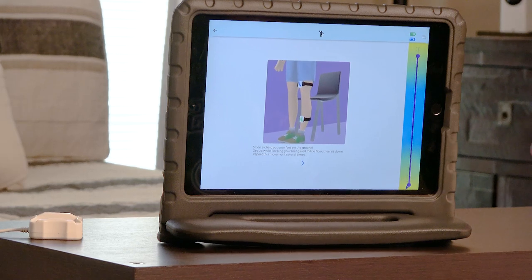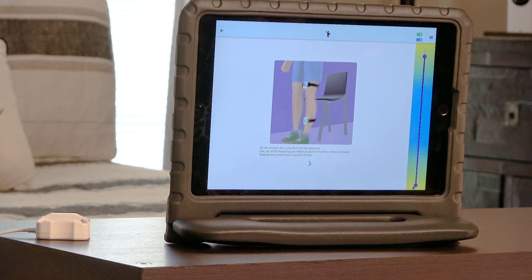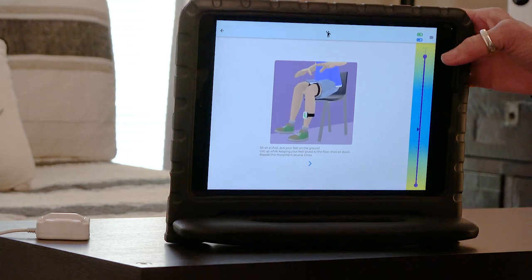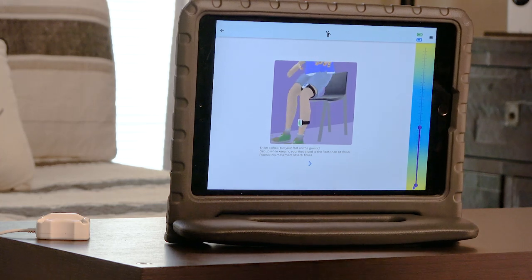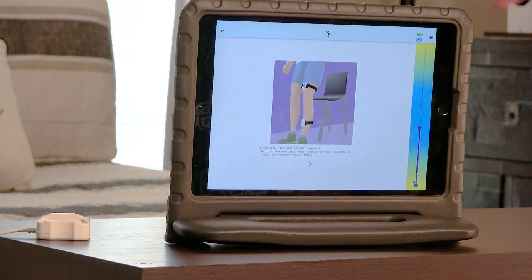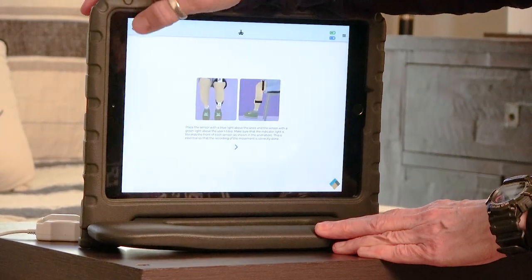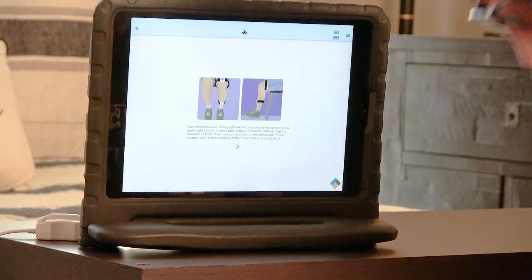Now it shows on screen the movement we need to make. You need to stand up — I'm going to keep a hand on you, try not to take me out. What I'm noticing is that you don't go through that full range of movement. I can see the sensors are not catching your movements. I'm moving sensors. I'm going to go back and choose my movement again and get these sensors repositioned.